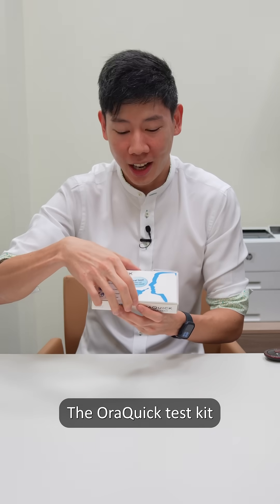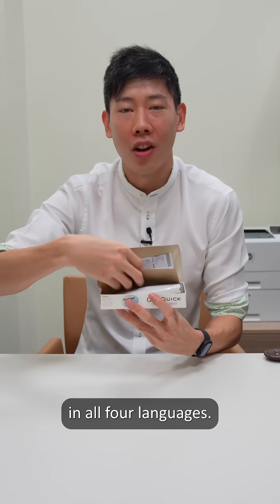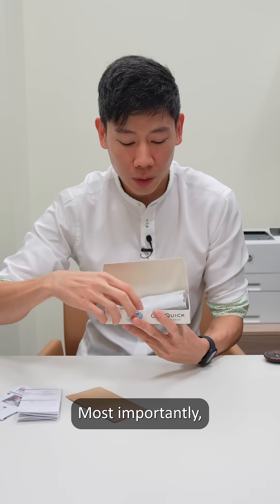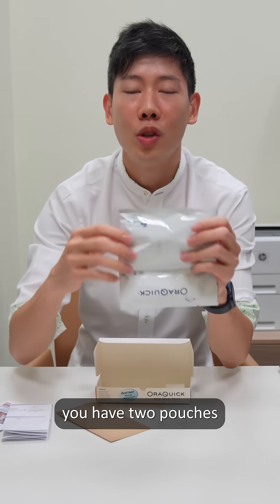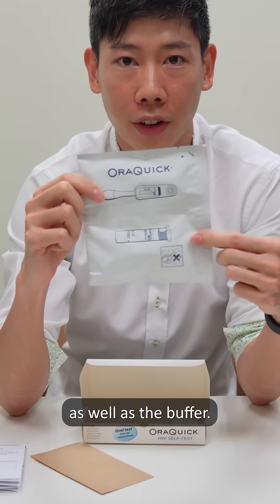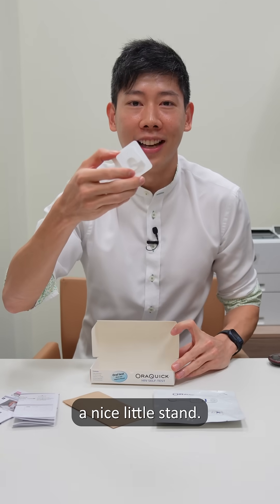The oral quick test kit comes with instructions in all four languages. You have a disposal bag below. Most importantly, you have two pouches with the test itself, as well as the buffer, and finally a nice little stand.